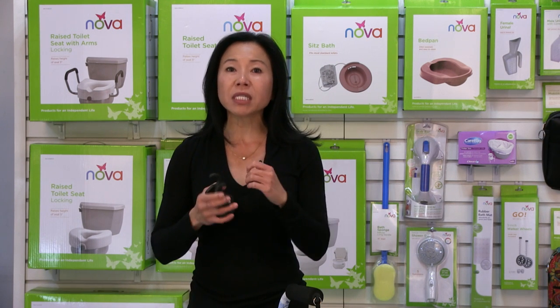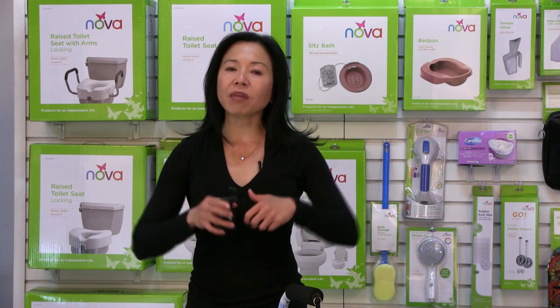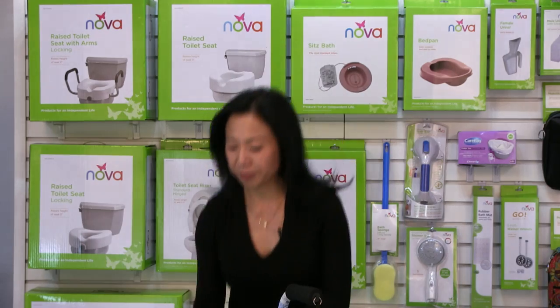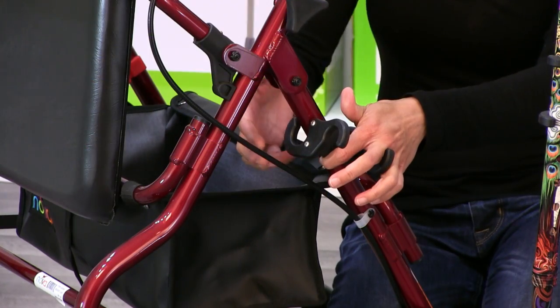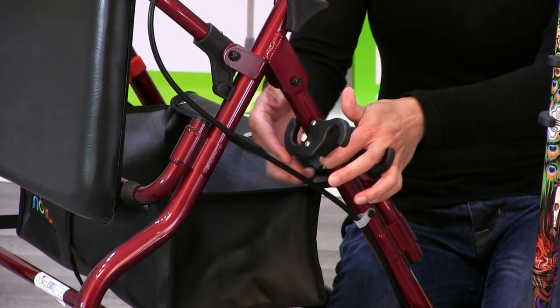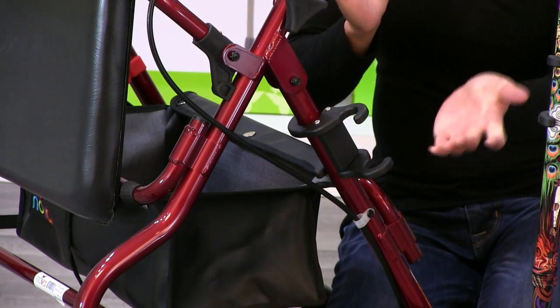Once it's on you can get it off, but it takes a little bit of muscle, so we expect that once you put it on it's going to stay there. You can move it so it's out of the way. I'm going to show you how to clamp this onto a rolling walker. I like to lift up the seat when doing this — just gives me more room. I've got the wider diameter here and I'm just going to hook that around so it hugs the tube on one side and the other.